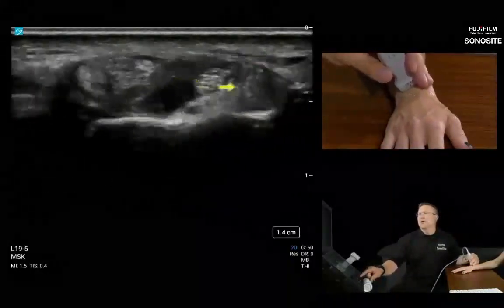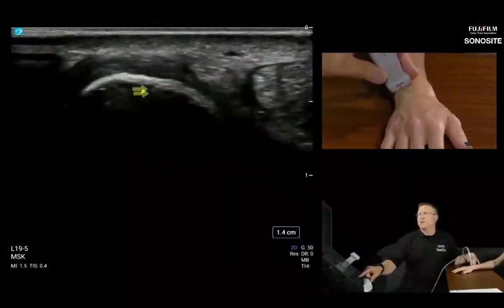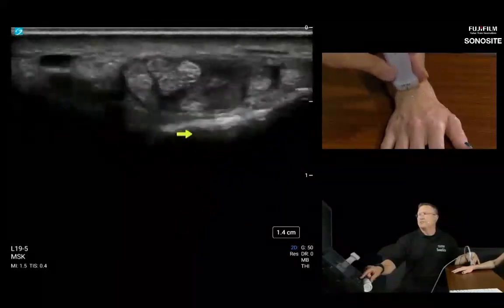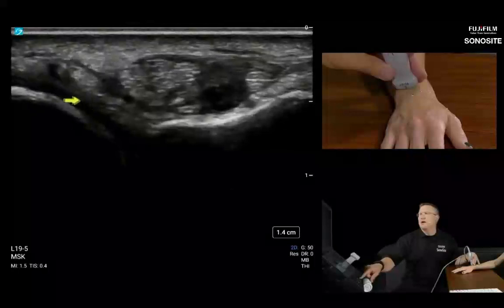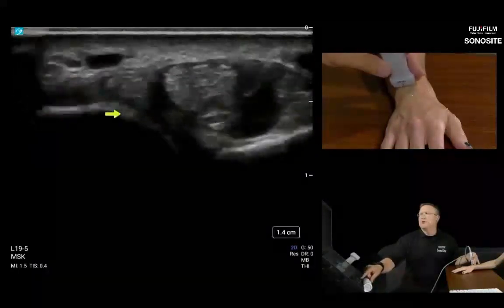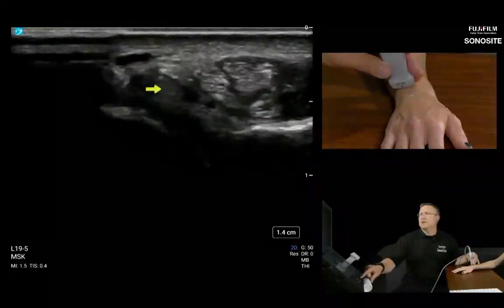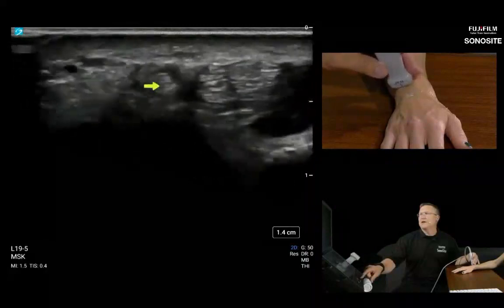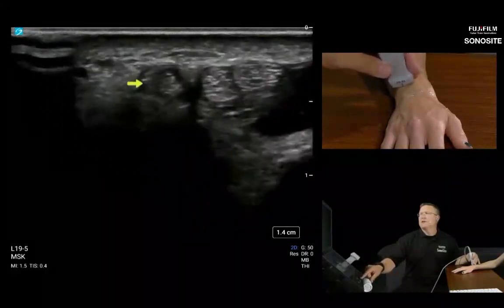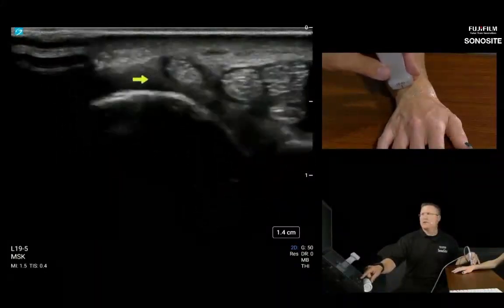So that's compartment 4. I'm going to slide over to compartment 5, and we locate compartment 5 between the ulna and the radius. Between the ulna and the radius, we have another retinaculum here, this bony bridge between the two bones. And then above compartment 5, we have another retinaculum. So this one just really hangs out like a hammock, like we talked about in the slides. And this right here is the extensor digiti minimi, which conveniently controls the pinky. If you're an Austin Powers fan, you'll get the reference.